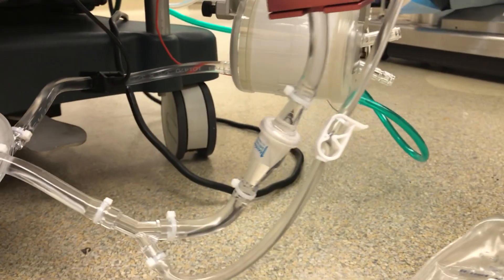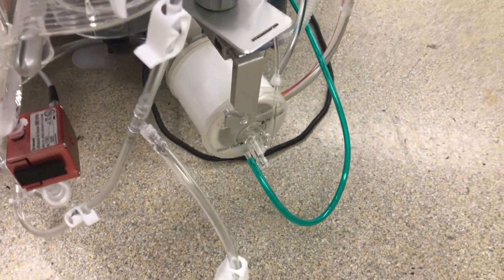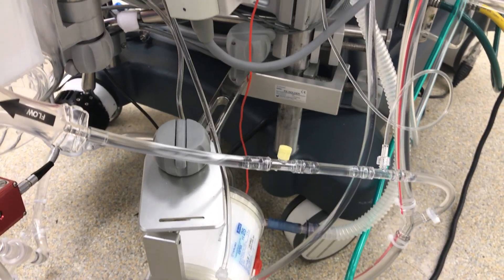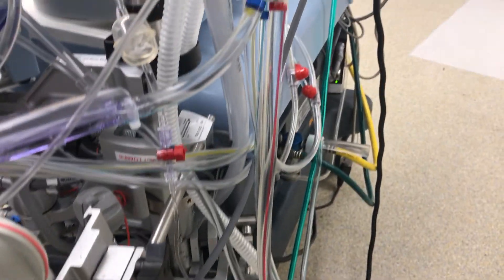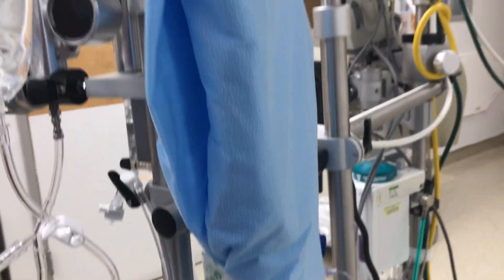As the blood flows into the oxygenator, it goes around the outside of the little tubes. The little tubes carry a mixture of oxygen and medical-grade air, and then the blood will decarboxylate and oxygenate. From there it will come out this side and go back to the patient, where it will go into a tube into the aorta. That takes the bad blood out through our system and back into the patient.